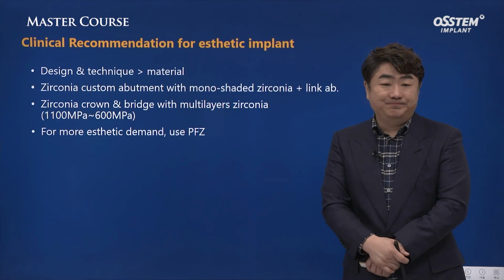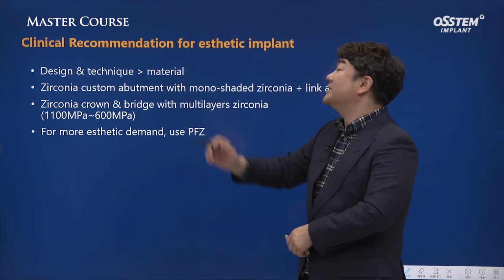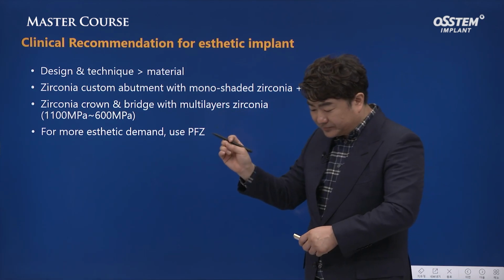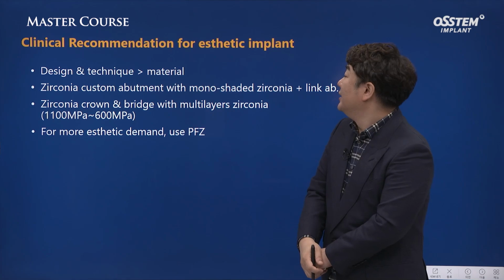More so than the material itself, we need to have a good understanding of the case. We need to position the implant accurately, and we need to have also a thorough understanding of the design. Please keep in mind that understanding the design is more important.